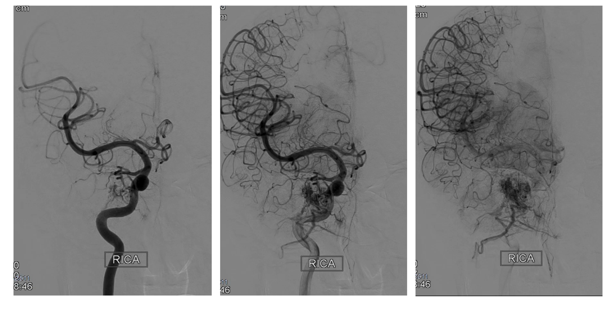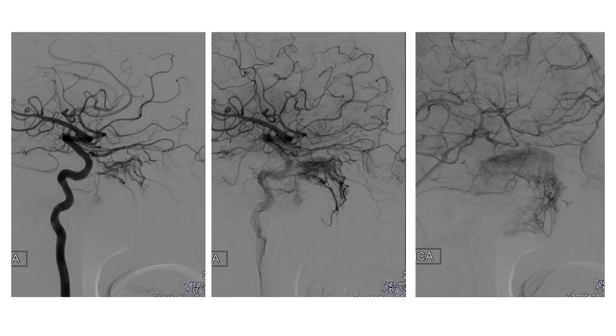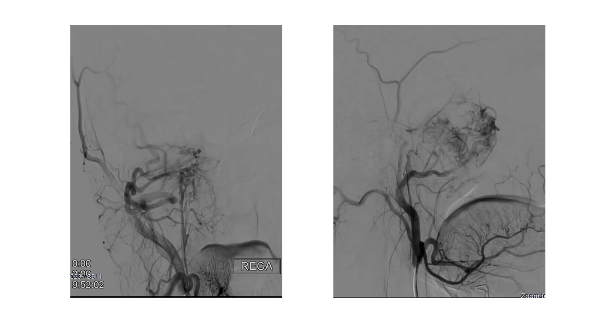We can see nice visualization of the intracranial circulation, and we can see the mass filling quite significantly from the internal carotid artery as well. The lateral demonstrates the finding much better. We can see feeders directly from the internal carotid artery as well as from the ophthalmic artery. So this is the tumor blush from the ICA run.